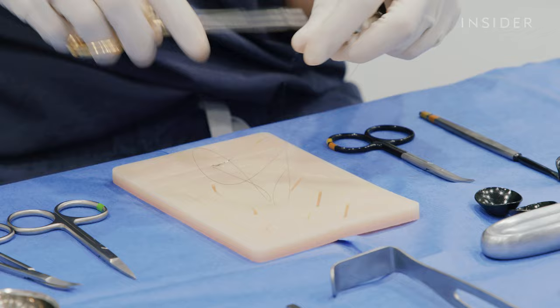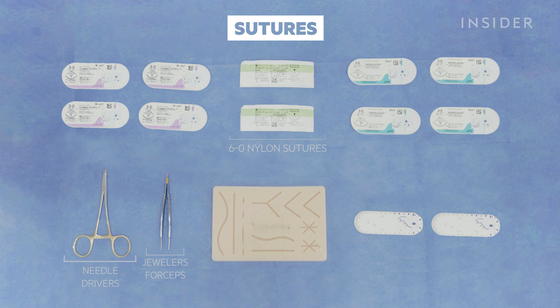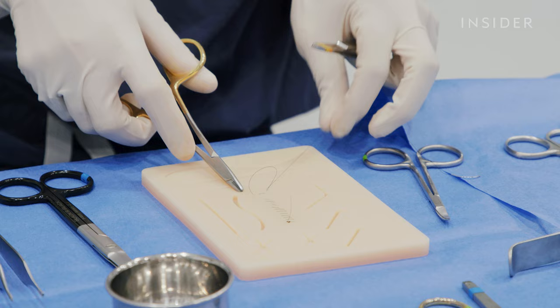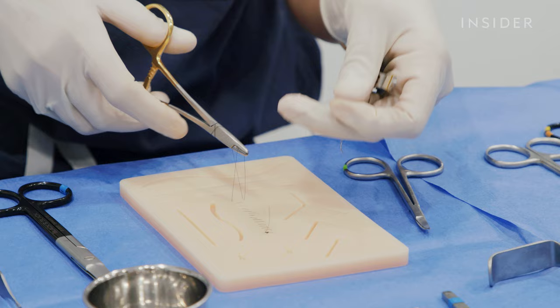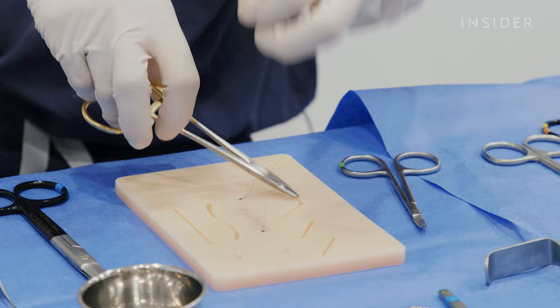So there are many types of sutures that are important in plastic surgery, and there are two main categories of sutures, dissolvable and non-dissolvable sutures. And dissolvable sutures are used in areas where wounds are a little bit more forgiving. And non-dissolvable sutures are important in more cosmetically sensitive areas. So if something is very precision oriented, you're going to use a non-dissolvable tiny, tiny stitch. And that's what I'm using right here.